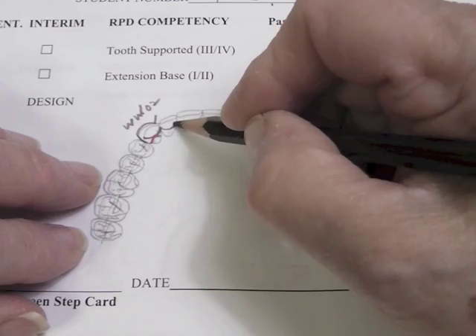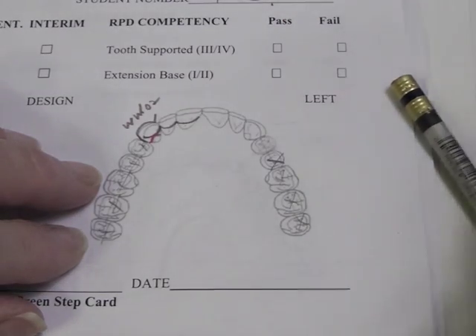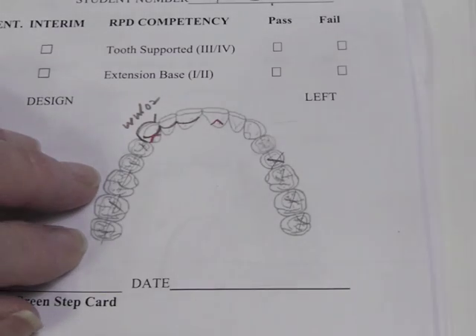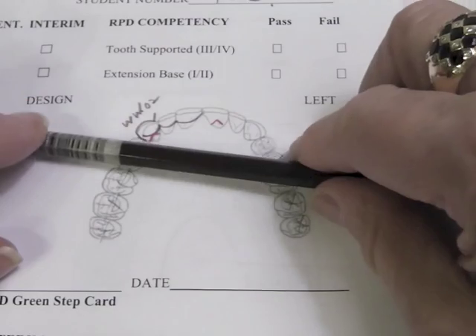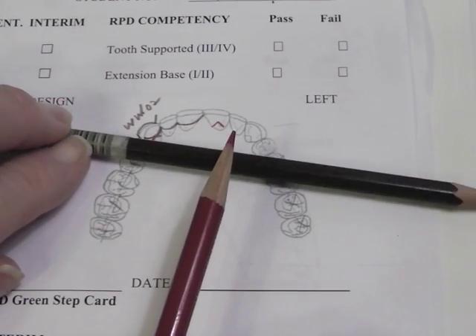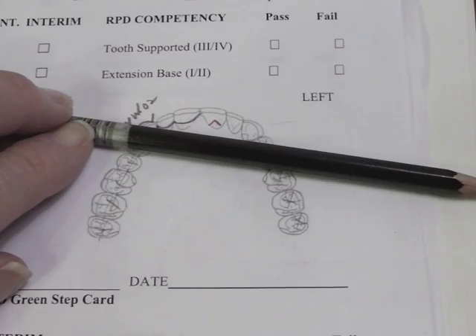I'm going to plate these teeth, and as an indirect retainer to prevent rotation of my partial in an upward vertical direction in the posterior area when eating, I place an indirect retainer on the tooth that is farthest away from the fulcrum line. My fulcrum line is between my two abutment teeth — that first premolar and the canine — and the tooth farthest away from that is my central incisor.